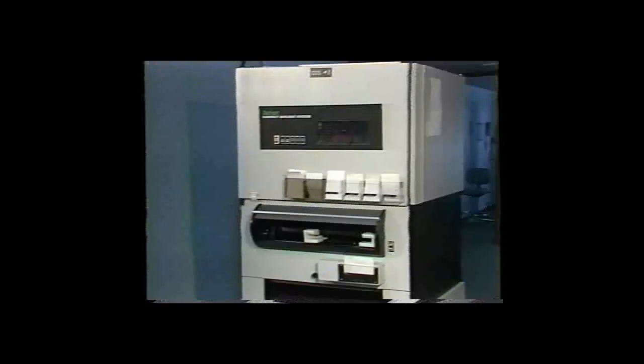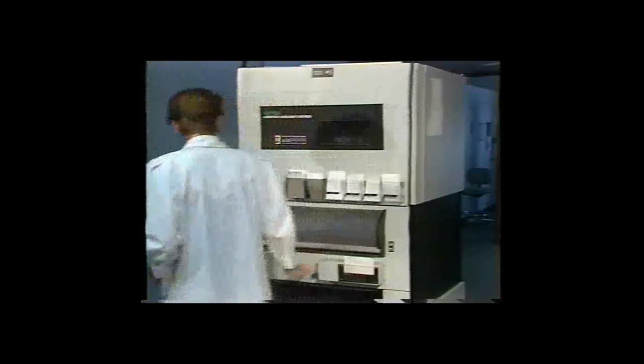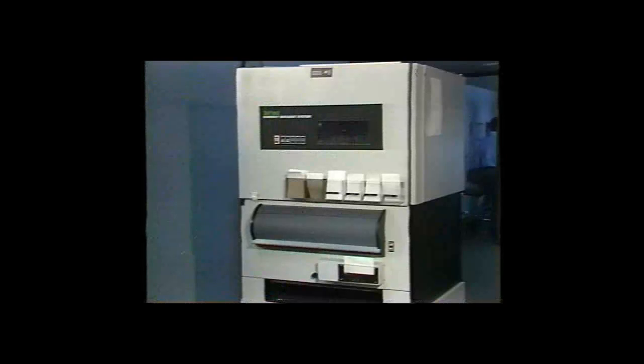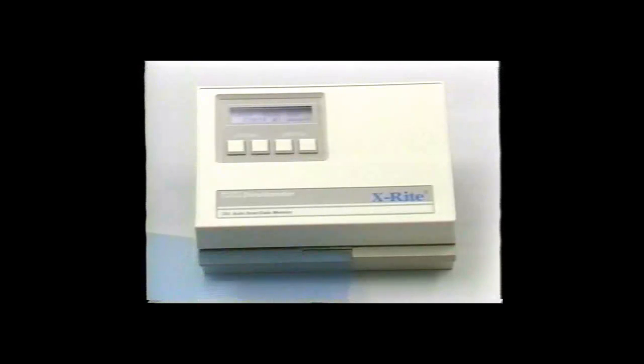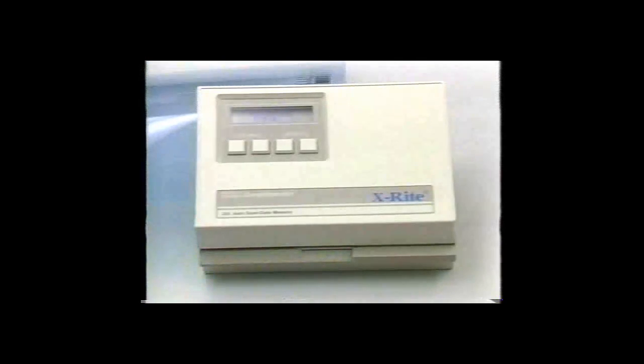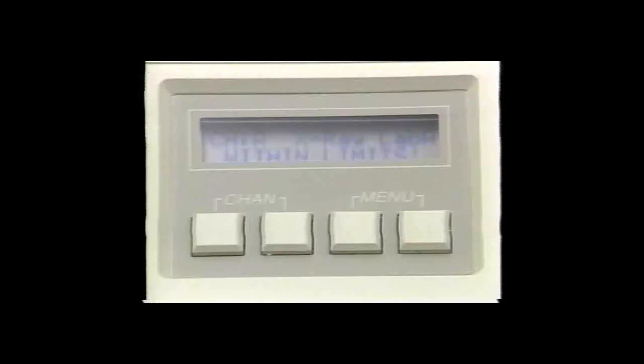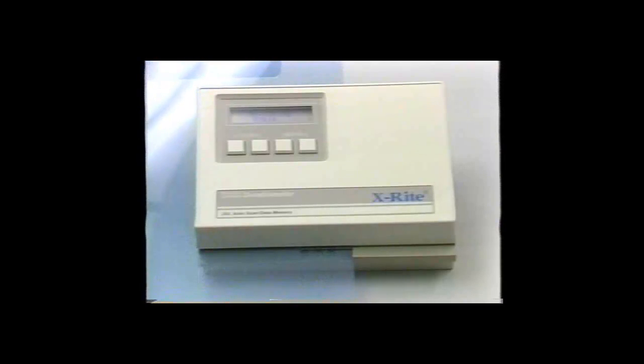If you're keeping a daily log to make sure the processor is in control, there's an added bonus in the 381: a limit test function. You simply read a reference strip developed with seasoned chemistry and proper processor temperature and speed. Then each time you measure a control strip, the 381 will compare those readings with the reference strip data, and the display will indicate if the control strip data is within or exceeds the limits you have set — a convenient alternative to your daily control log.